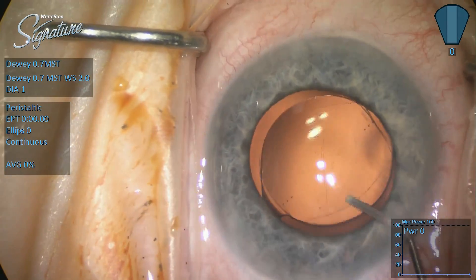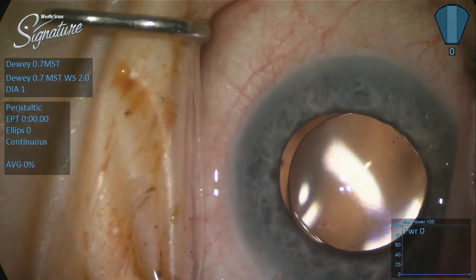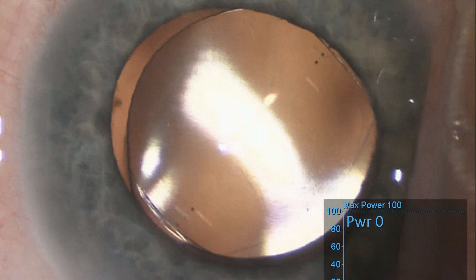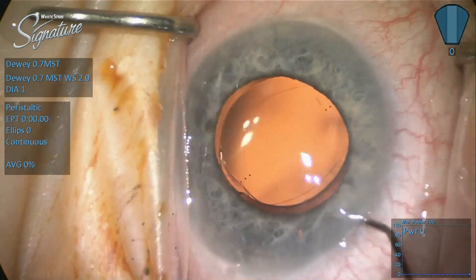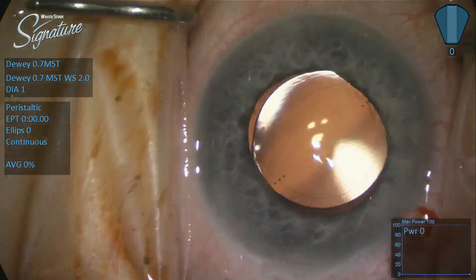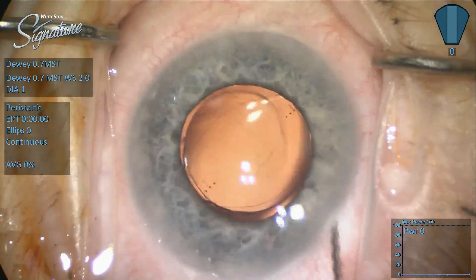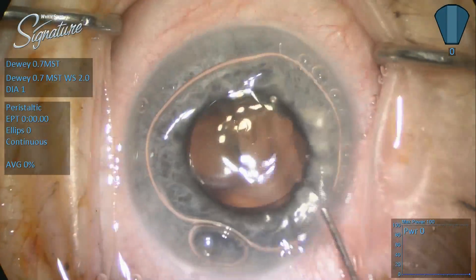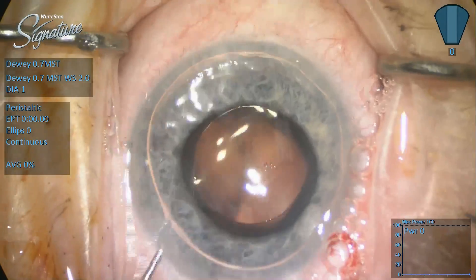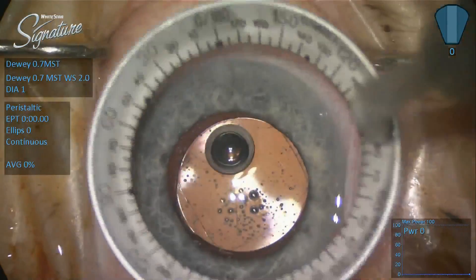The square-edged optic is anterior to the capsule, so there is always the potential for chafing of the posterior surface of the iris. But in this case we've got a very deep eye, and we should have no problem clearing that space and not having chafing. Here we can see we've achieved really good alignment, and now the only problem is getting the rest of the viscoelastic out. I put air inside the anterior chamber to see how much viscoelastic is left — the air conforms to the viscoelastic, so when you see a regular outline, that means there's only BSS left, but an irregular outline means there's still viscoelastic in the anterior chamber.